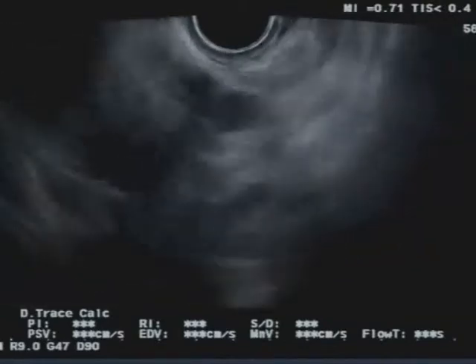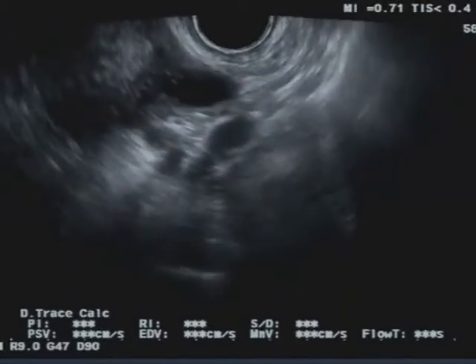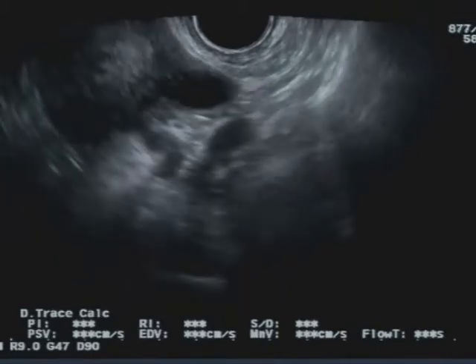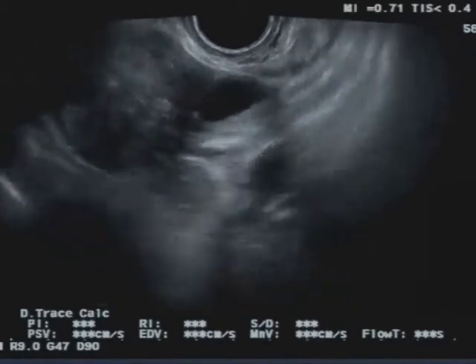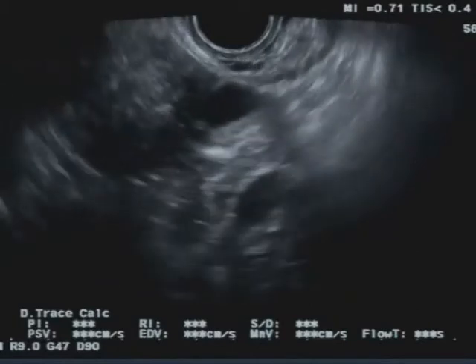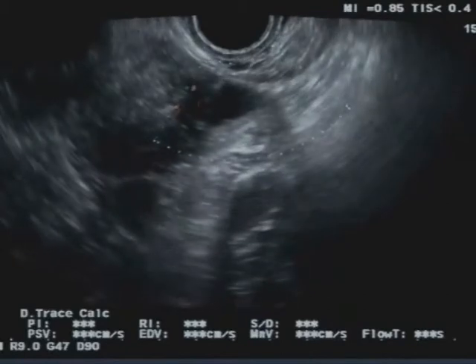During surgery, it was observed that the formation that we described previously, thought to be of ovarian origin, later proved to be of uterine origin. A histologic examination showed it to be a pedunculated uterine angiofibroma. Our reconsideration of the examination performed is that the cyst-like formations were small areas of colliquative fibroma.